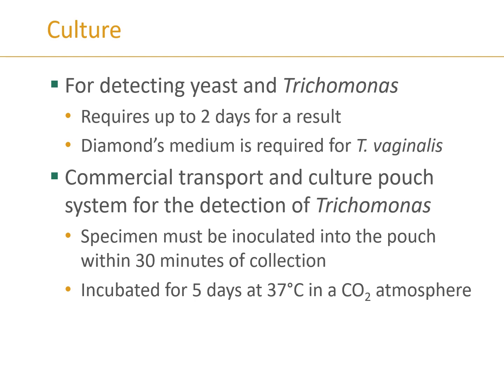Cultures could be performed for vaginal specimens, especially if they think they're looking for something odd or unusual that doesn't typically grow there. But more specifically, what's going to be commonly found would be yeast. They're just growing on a blood agar plate or chocolate plates, you could find those yeast present. Trichomonas would grow, but it does require special media.